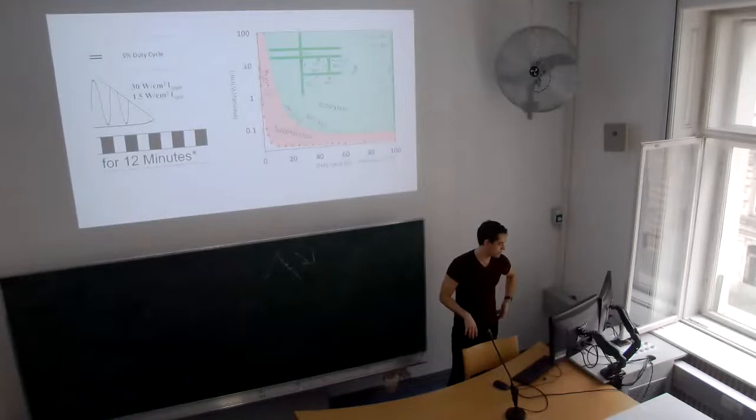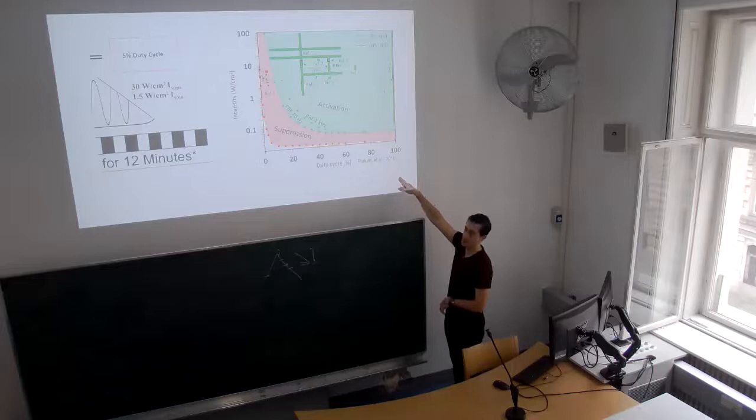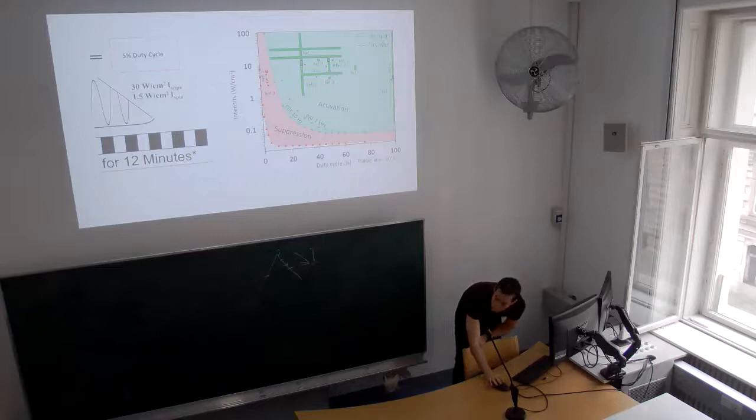Okay, so remember this duty cycle. Now, in recent years, ever since this landmark 2016 computational paper, people have become aware that this duty cycle thing is super important. I know this has two dimensions, intensity and duty cycle. It's a little complicated. But if you just take the intensities that are realistic, which is maybe here to here, any less, especially in humans through the thick skull, is not going to do anything anymore, and you're getting into kind of dangerous territory.